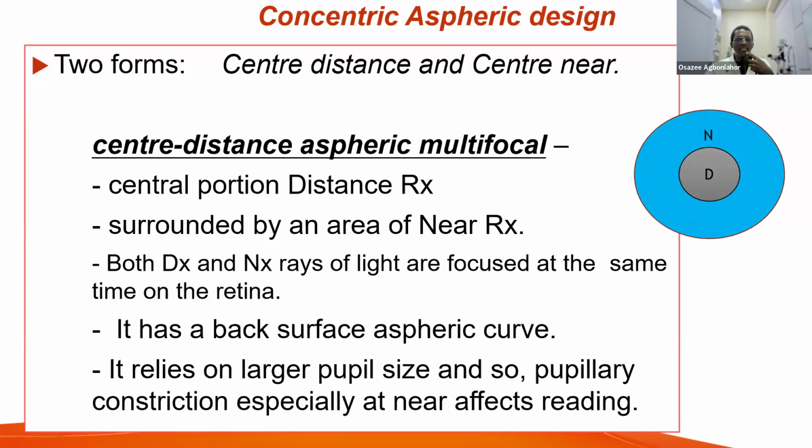Yes, very important. I said earlier that pupil size is very key. You cannot fit multifocal contact lens correctly for a patient if you don't understand the pupil size or how the pupil changes from dim illumination to normal illumination, and also to bright illumination. You must have that. So for center near or center distance, you must take note of the pupil size. Very important. So large pupils, like I said earlier, greater than 4 mm, usually very difficult.